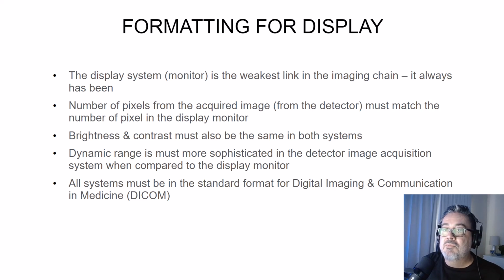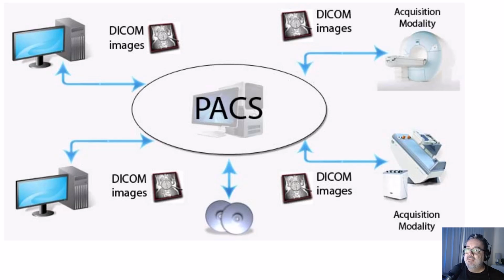All of the systems must be in the standard DICOM format. DICOM meaning Digital Imaging and Communication in Medicine. We're going to discuss that in the next module. As you can see, these DICOM formatted images are coming from every modality and stored into PACS. And this uniformity in formatting allows us to share images between different manufacturers and institutions.